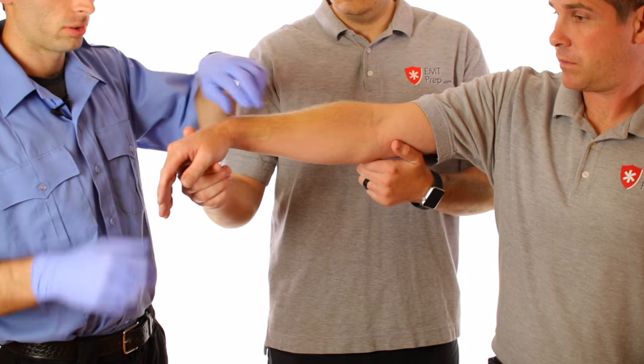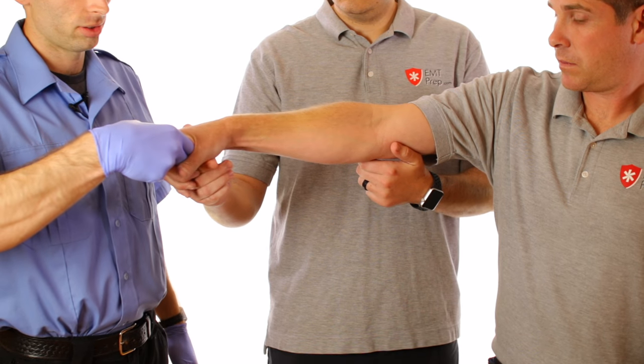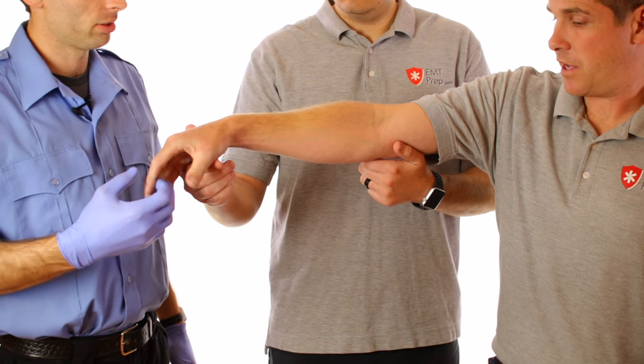I have a radial pulse. Can you squeeze my fingers? Can you feel me touching your fingers?